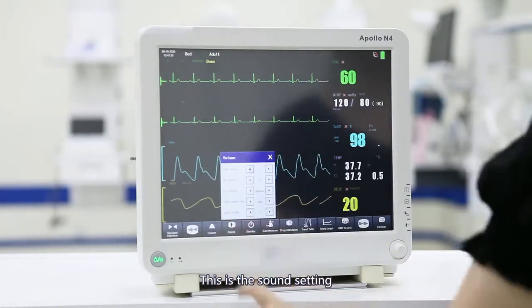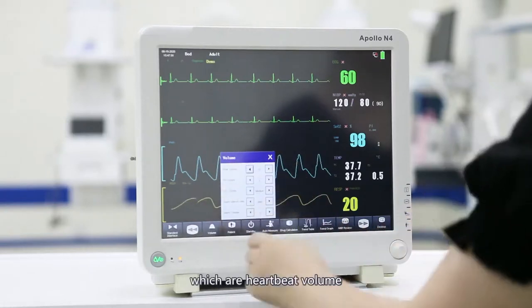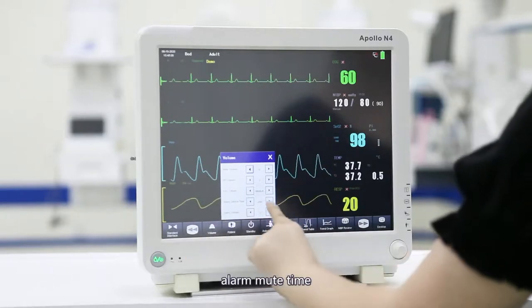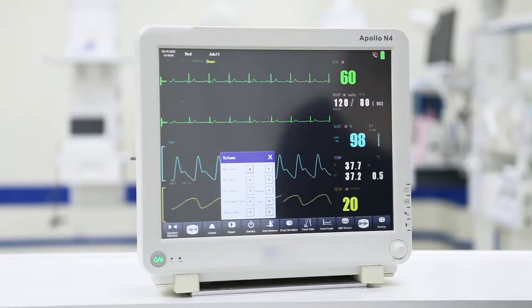This is the sound setting. There are five types of volume: heartbeat volume, pause volume, keyboard volume, alarm mute time, and alarm volume. You can adjust the volume of these parameters.